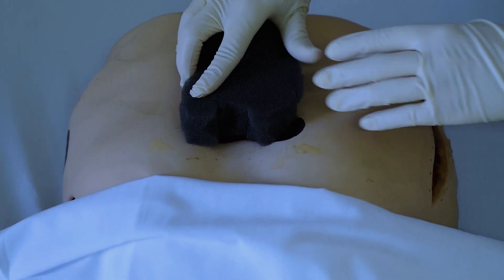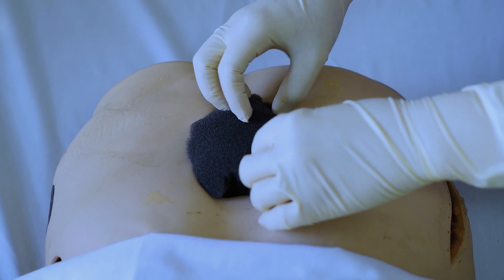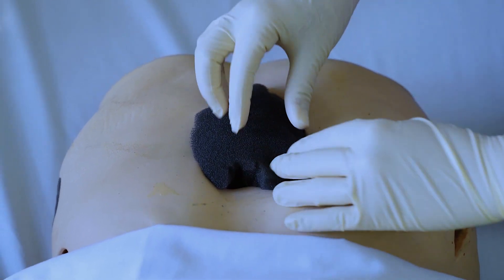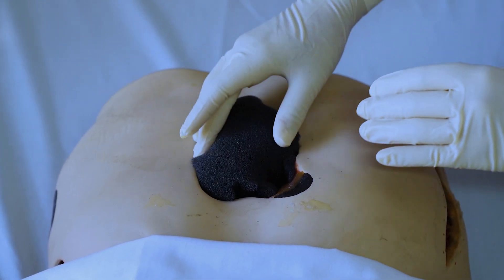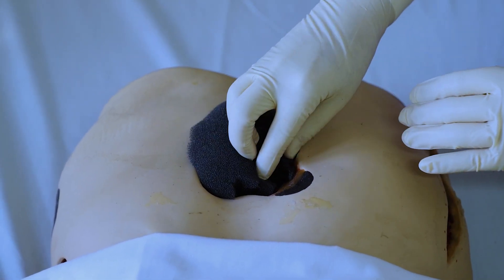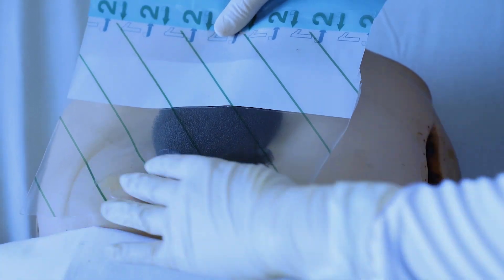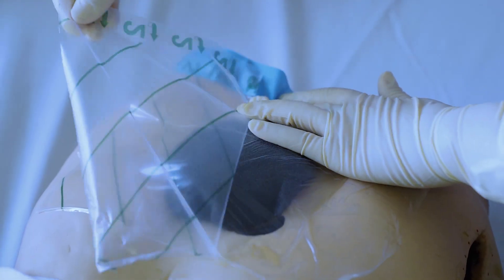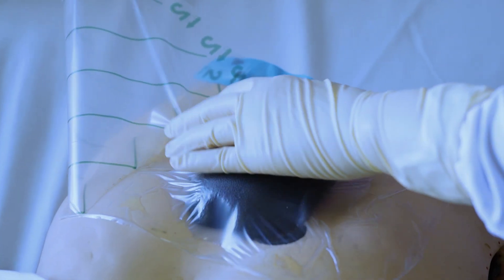Cut the foam to the shape and measurement of the wound using sterile scissors. Place the foam in the wound. The foam should fill the wound but not cover intact surrounding skin.